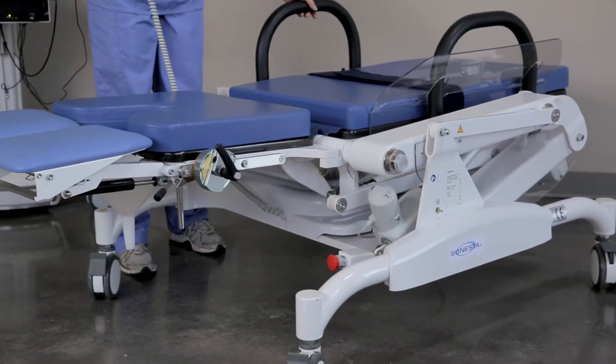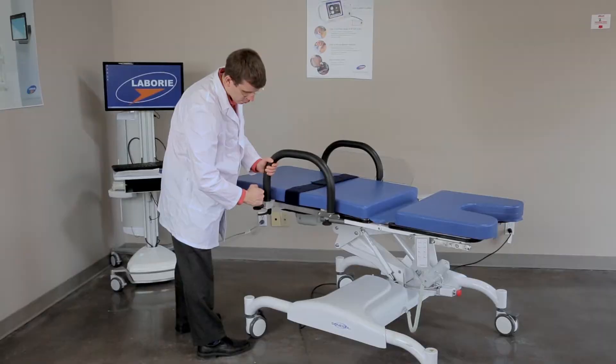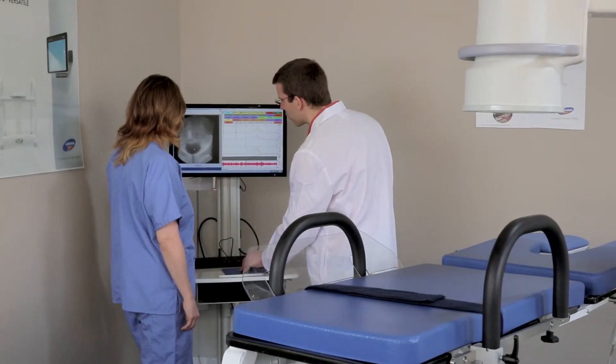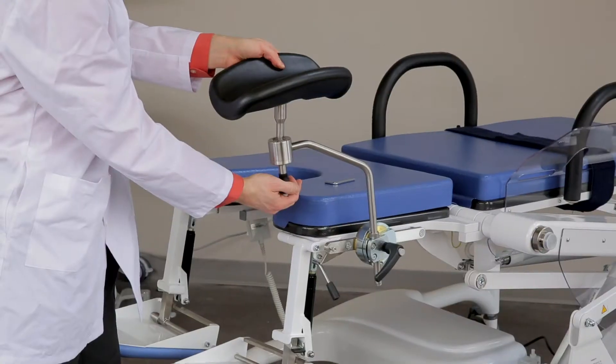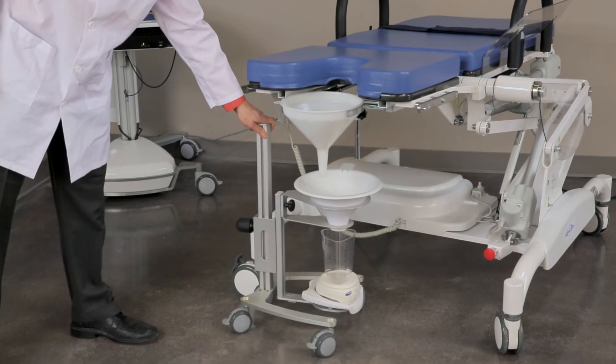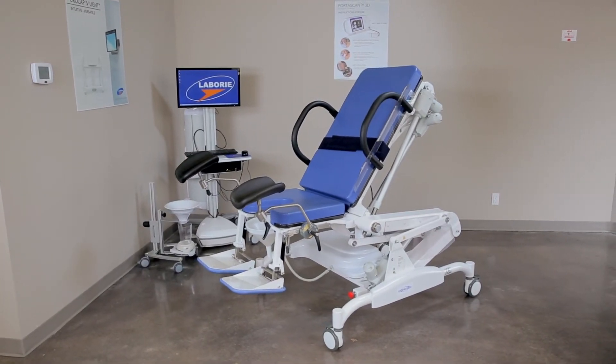The table can be lowered to a seat height of just 50 centimeters or 20 inches for transfer from a wheelchair, optimizing both the patient and clinician experience. A range of accessories are available for standard and video urodynamics examinations, along with general urology, gynecology, and gastroenterology procedures.